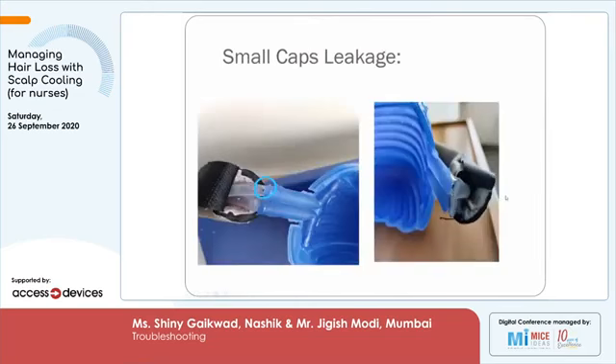There is a definite rupture of the tubing at the junction of the cap and the silicon tubing, which has happened due to heavy kinking of the caps. When the patient is sleeping, she may be uneasy from the cold on her head and move from side to side. Nurses have to continuously watch so that there is no kink in the cap. If the tubing is flipped on the cranial side, it is going to cause a heavy kink, stopping the flow to the cap and potentially rupturing the tubings as well.